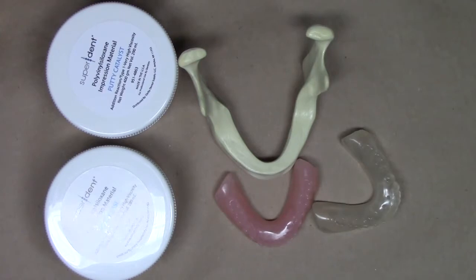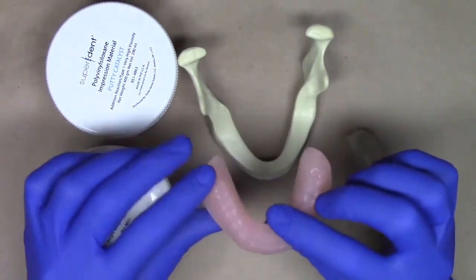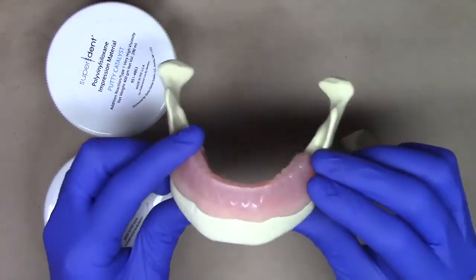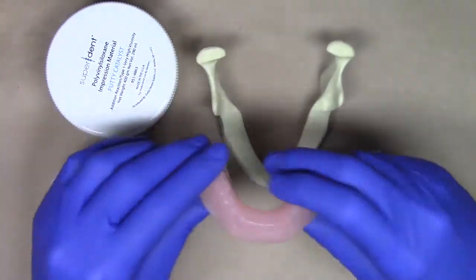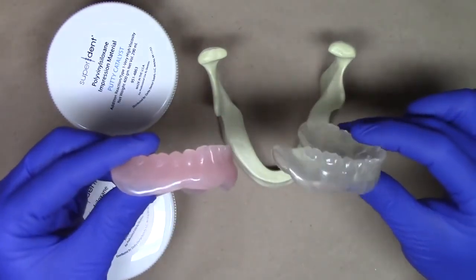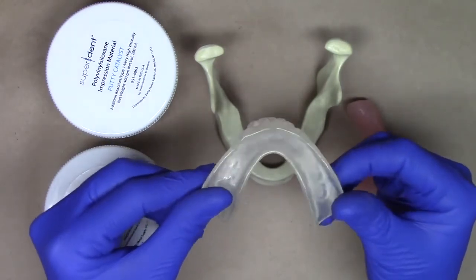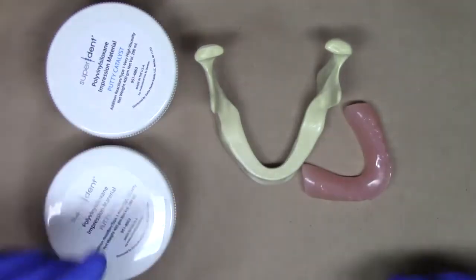What we're going to do is take our patient's existing complete denture, which is similar to what I have in front of you. This is a denture that is meant to fit on top of this replica or study model that we use for implant placement exercises. We're going to duplicate this into this clear duplicate of that patient's complete denture, and then also show you how we prepare pilot holes to assist in implant surgical placement of the LOCATOR Overdenture implants. I'm going to put these aside for now.